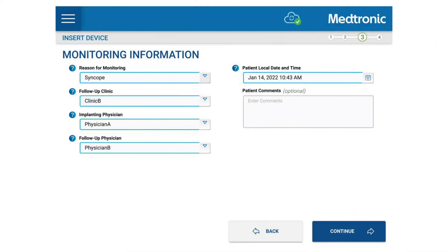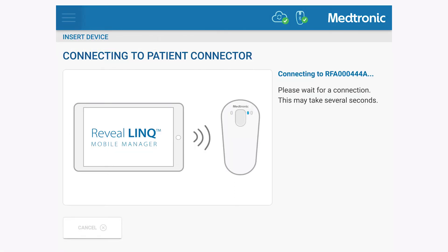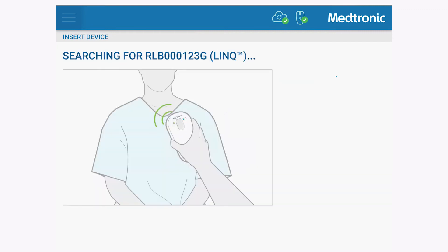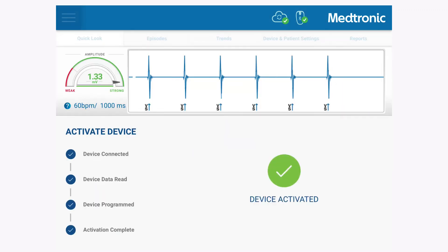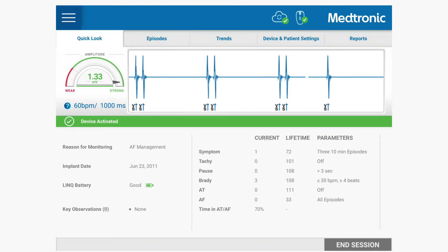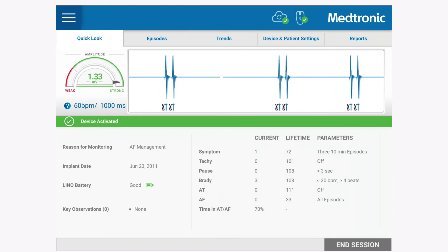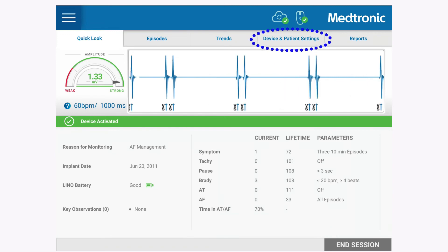The following information — including the patient's reason for monitoring, follow-up clinic, and implanting physician — can be added after associating the monitor. Each reason for monitoring has specific nominal programmable settings. These nominal settings can be changed on the device and the patient's settings tab after R-Waves are confirmed.